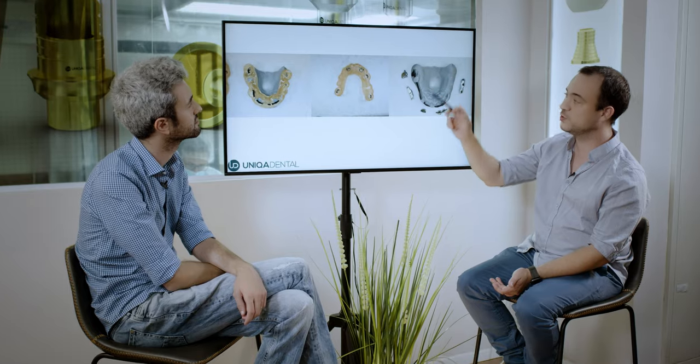Teeth that are fine, I don't want to extract. You need to extract these teeth, so the surgical guide relies on this kind of abutments also.